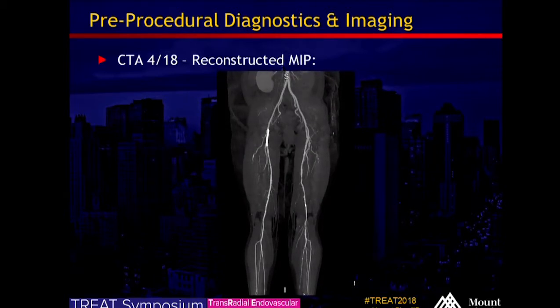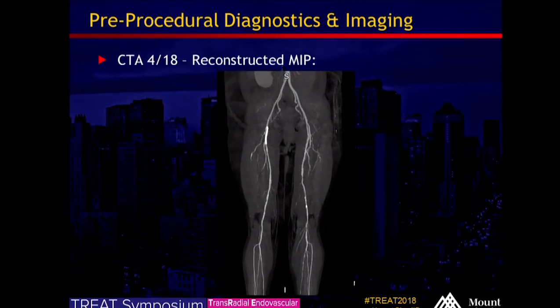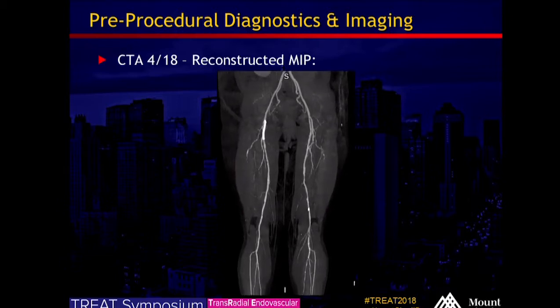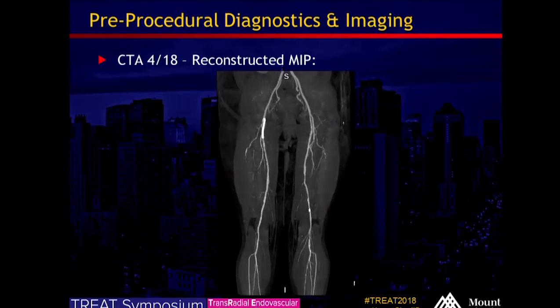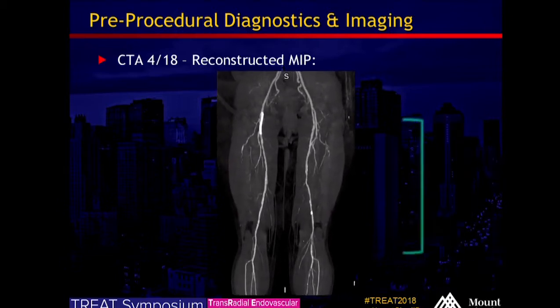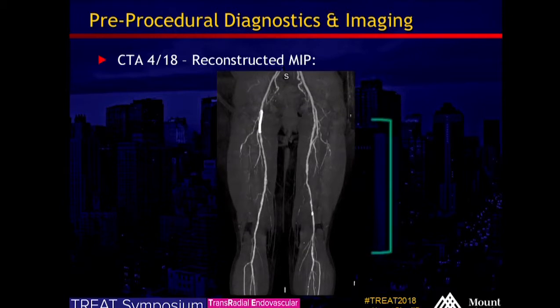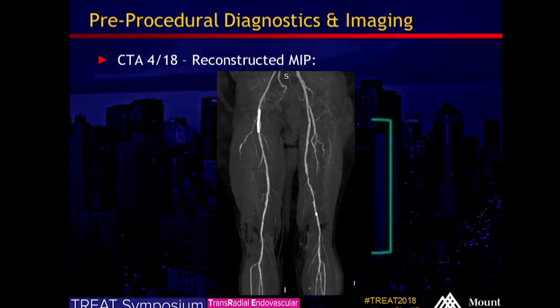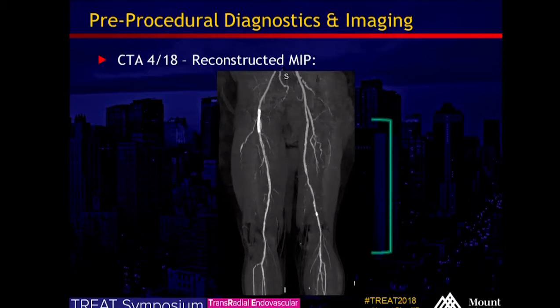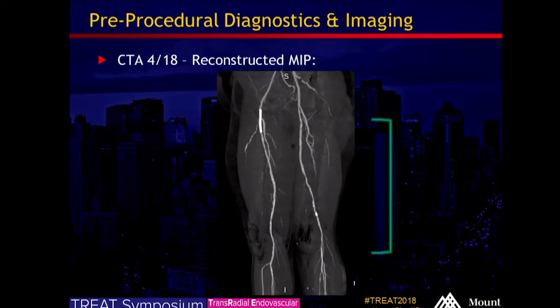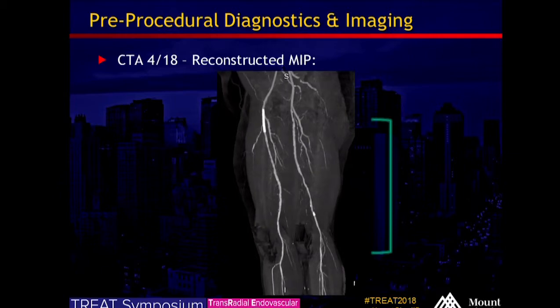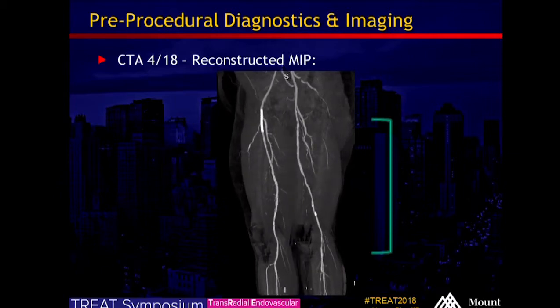Maximal intensity projection images through the CT further delineate her left SFA disease. We have a little bit of proximal SFA disease, but it looks like most of the disease is lower down, mid to distal.